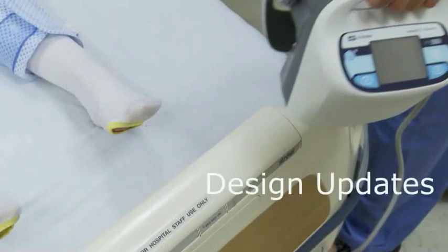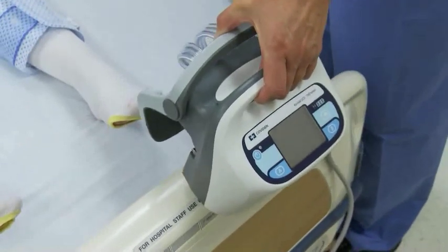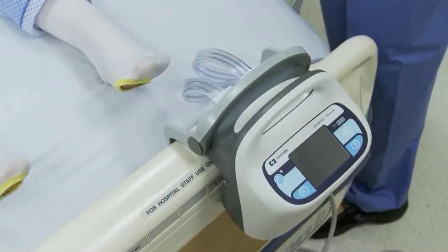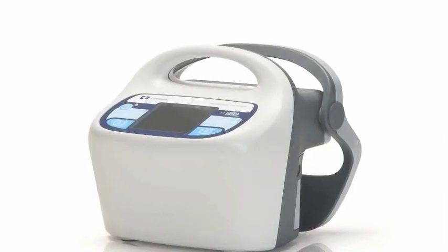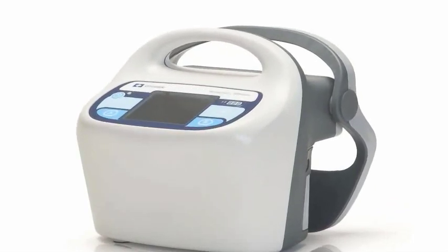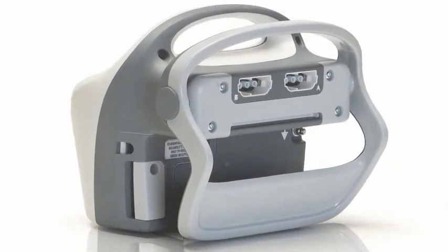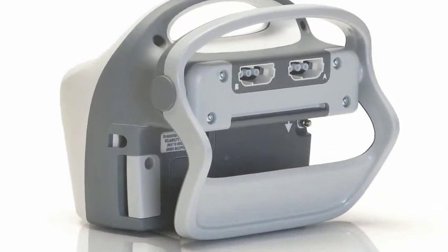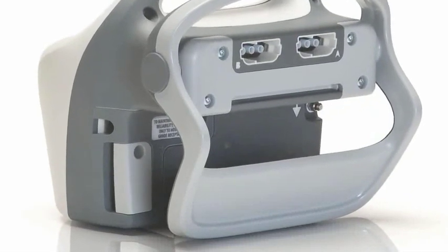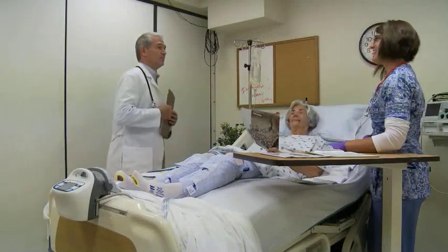Covidien has made multiple design updates to further enhance the user experience. Such improvements include an adjustable bed hook to accommodate a wide range of bed sizes, and improved durability by using a more robust material and molding design. The 700 series is able to withstand the rigorous hospital environment, and the new material will stand up to the majority of cleaning agents.